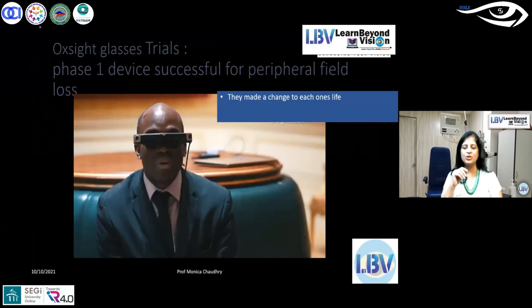You know why I showed you this before I move on to another expression video, which was on the prototype when we were doing it? I didn't know it myself. We've always been tuned with our brains to understand visual acuity. For us, it is improving from one visual acuity, not much, only 6/60. Doesn't improve much, only 6/24. And we ourselves lose heart on giving the devices.